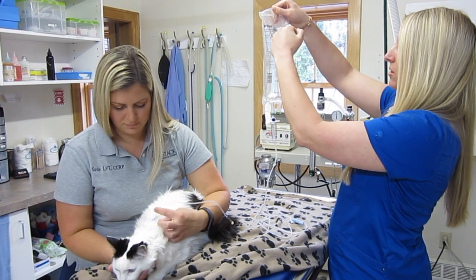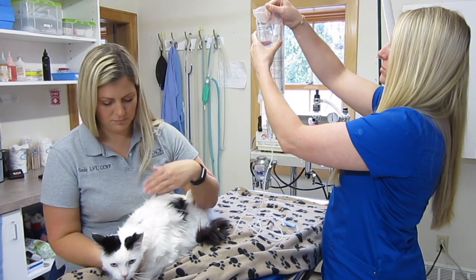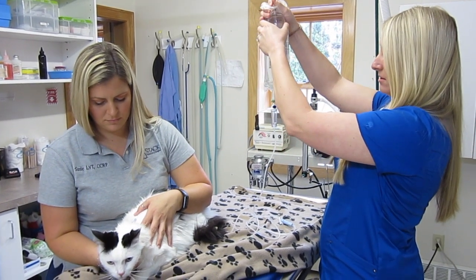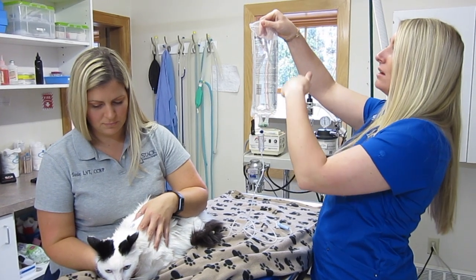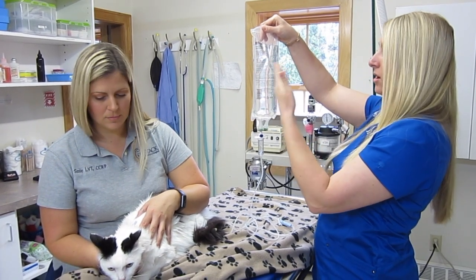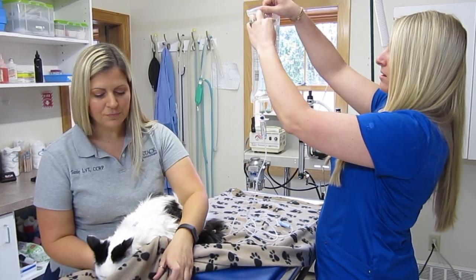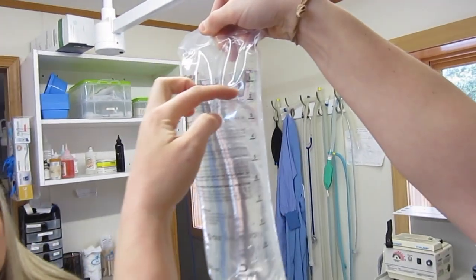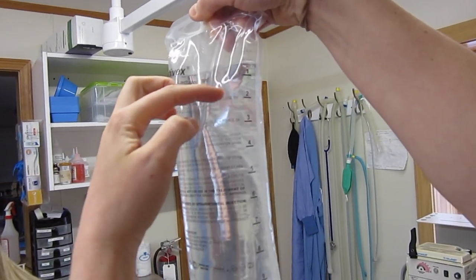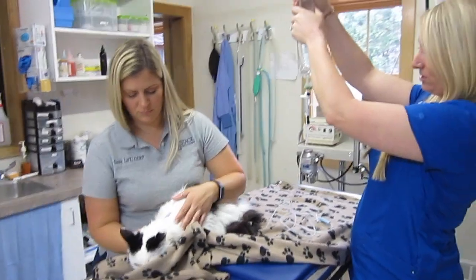So most bags go by 100 mL increments. So I'm going to just squeeze my bag to make it go a little bit quicker. But right now, again, this is a completely new bag. So there should be close to 1,000 mLs in this bag. So I'm actually going to go down to between the 1 and the 2, and that would equal 150 mLs. I'm just going to squeeze it.